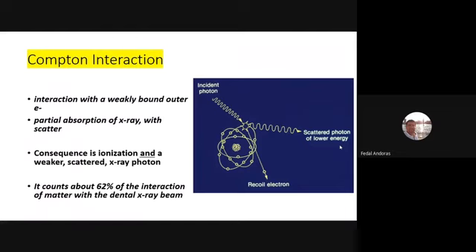Again, this will work better with high kV, and this will have its impact on seeing contrast or soft tissue. That's why it's easier to see soft tissue using medical CT rather than dental X-ray or dental CBCT. This is just rough information for you, but these have an advantage in seeing soft tissue by using X-ray. But it's not your business at this point, okay?